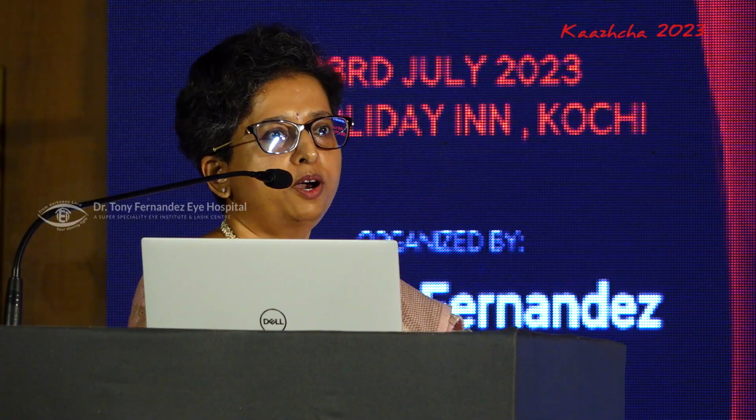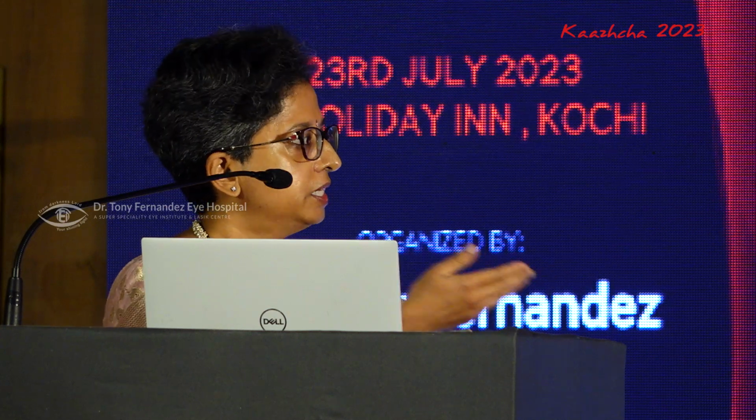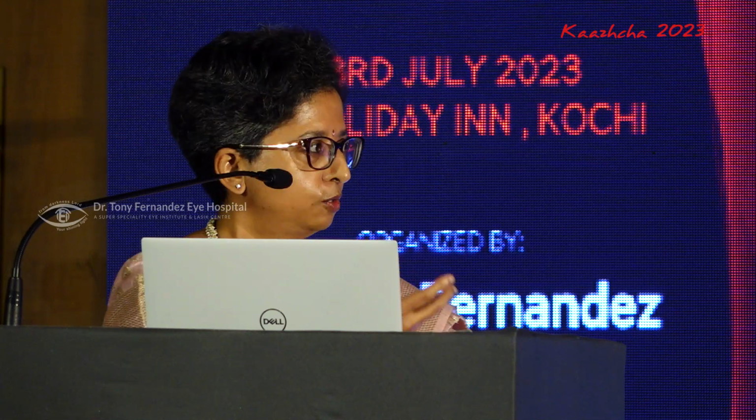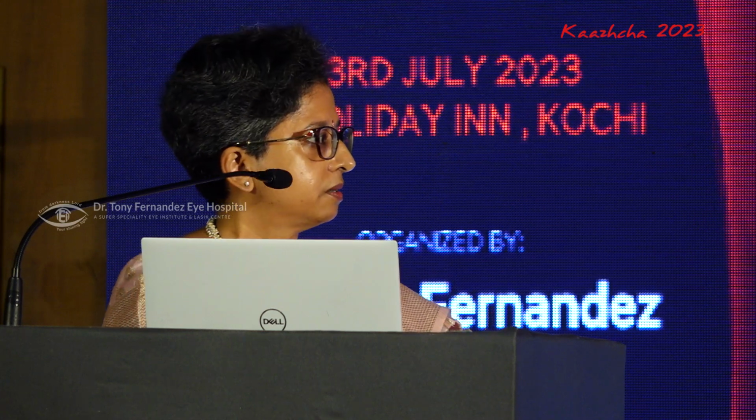And in this port, you can put a plug once you have formed the AC, so that the vitreous doesn't keep on coming into the port. And at the end of the surgery, though this is an MIVS port, I strongly recommend you should suture the port. I usually make them myself, so I invariably suture it, because the VR surgeons make it in a tangential way, so that it is valvular and it doesn't need a suture. But for these cases, I always suture the port.